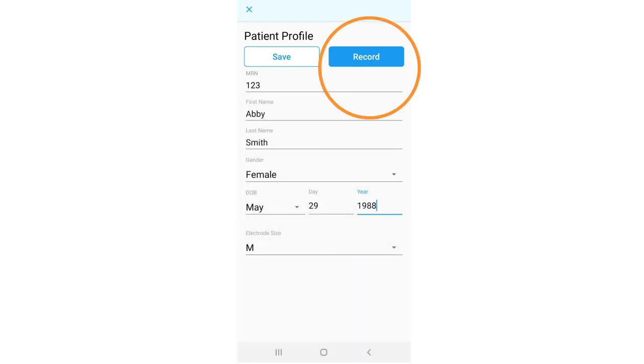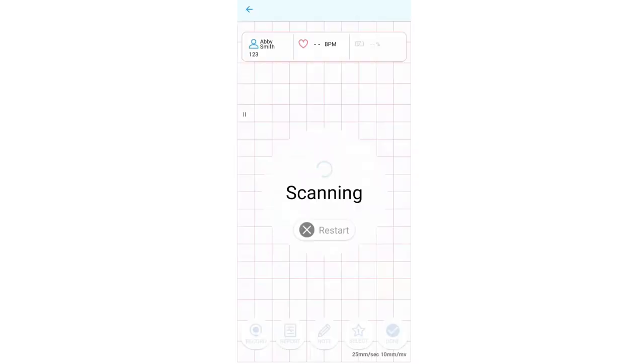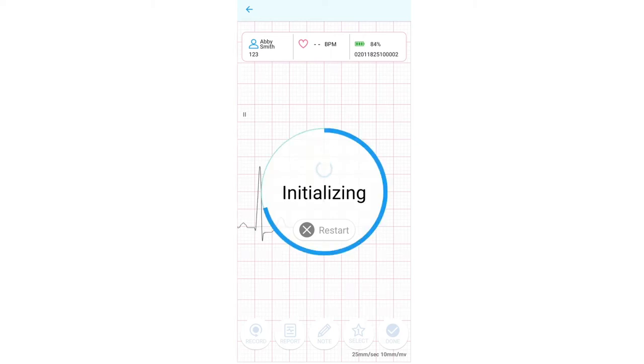When you are finished, click on the record icon to start recording. The app will automatically scan, connect with PCA 500 recorder, and initialize recording.